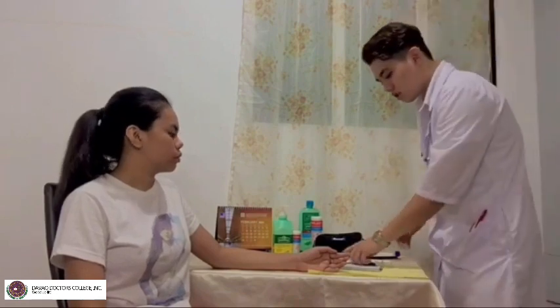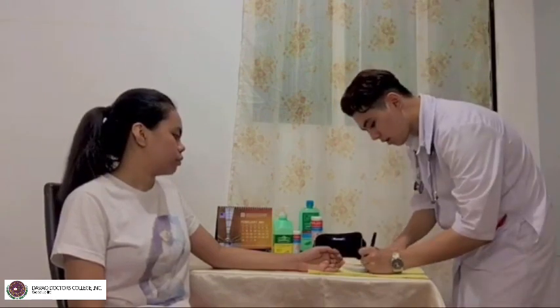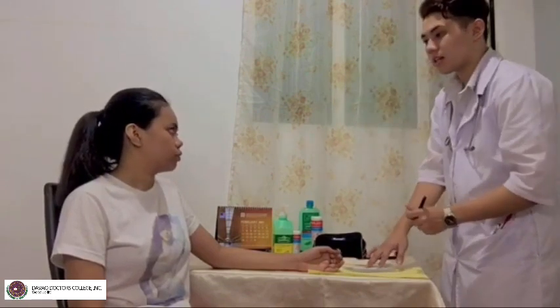So, now we need to compare the pulse rate to the baseline data or the normal range for the age of the client. Now, we need to relate the pulse rate, rhythm, and volume to other vital signs, baseline data, and health status. So now we need to document this one. While documenting, ma'am, do you have any other questions?